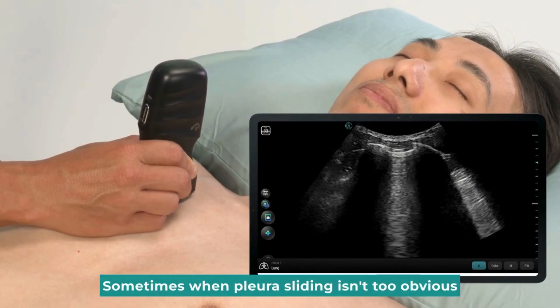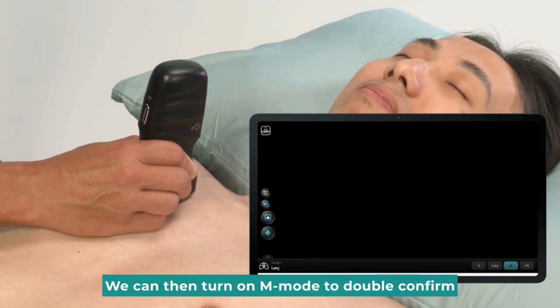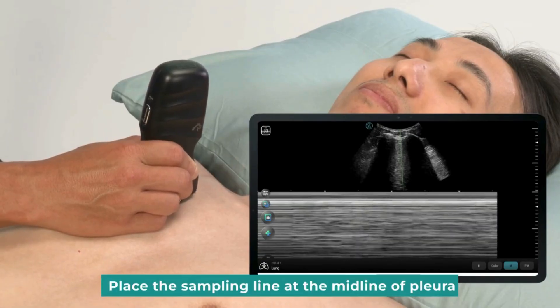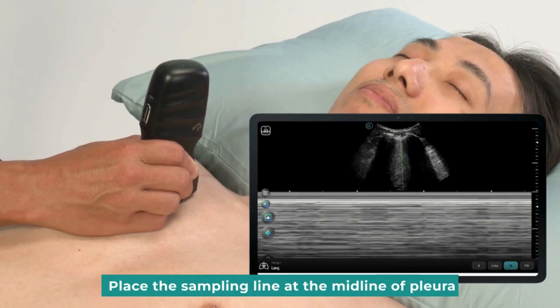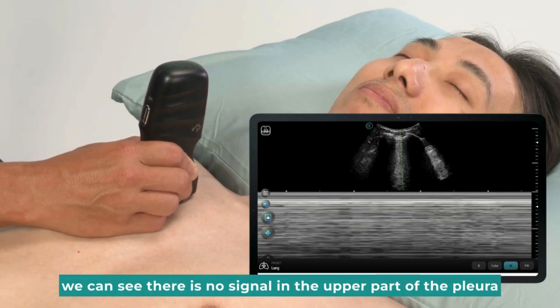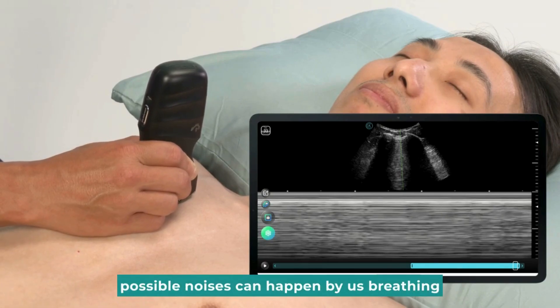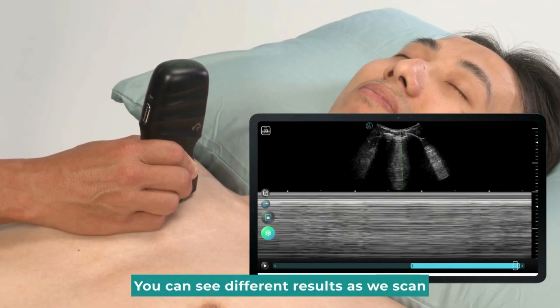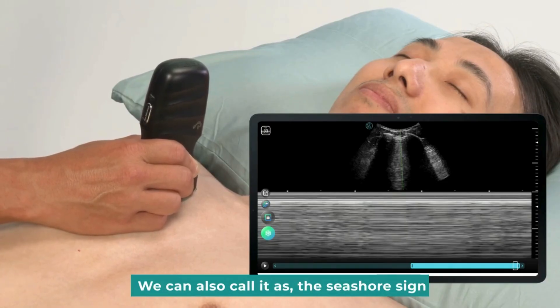Sometimes when pleura sliding isn't too obvious, we can then turn on M-Mode to double-confirm and observe the sliding appearance. Place the sampling line at the midline of the pleura. We can see there is no signal in the upper part of the pleura. Always check the line at the bottom — possible noises can happen from breathing. You can see different results as we scan. This sliding in M-Mode we can also call the seashore sign.